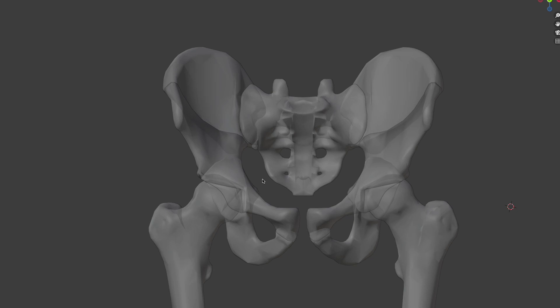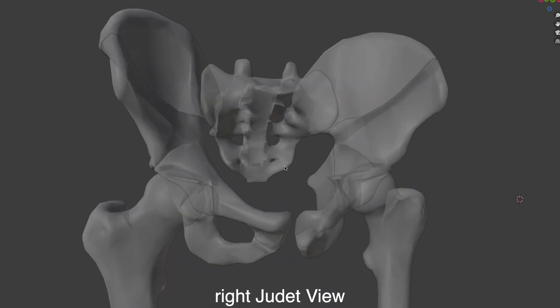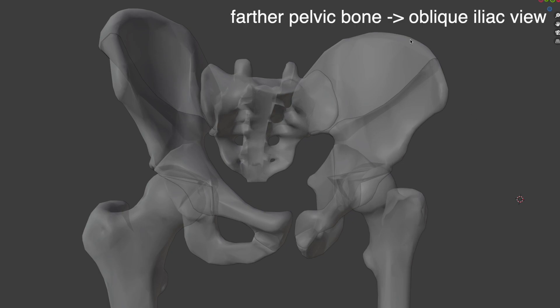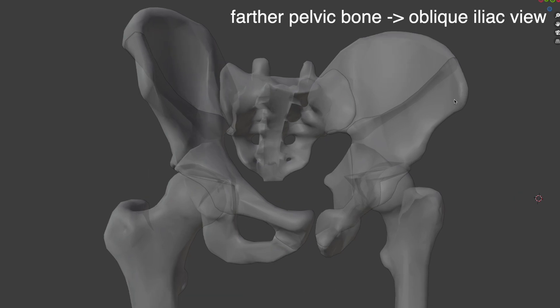In addition to the usual AP view, other important views for acetabular fractures are the Judet views — basically the AP view rotated 45 degrees to either side. Using the right Judet view as an example, it can be divided into two sub-views. On the far side — the left pelvis — this is referred to as the oblique iliac view, because a large portion of the iliac bone is clearly visible. The side closer to us — the right pelvis — is called the oblique obturator view, because the obturator foramen is clearly visible.